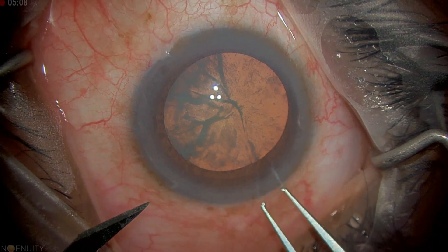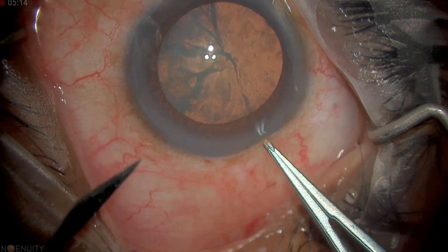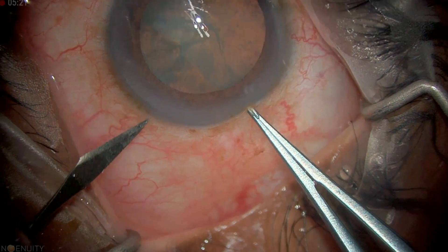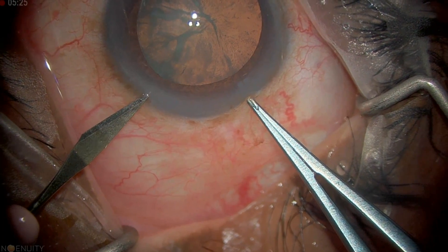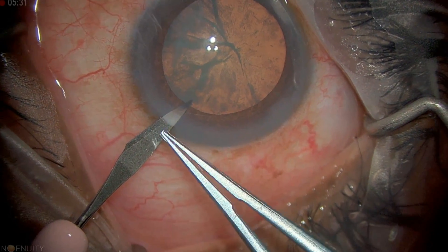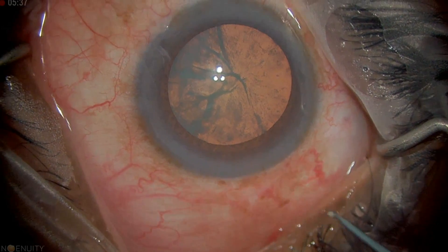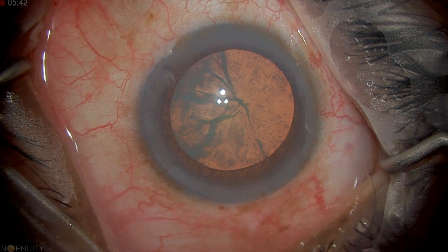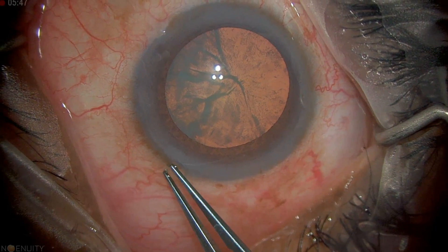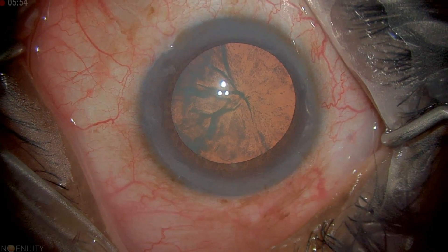I like to grab where I'm going to make my main incision. There are many ways to do this — I'll just show you mine. I like my paracentesis port about 70 to 90 degrees away, going pretty flat, just at the limbus, entering and going straight in. I'm looking at my internal diameter and gauging a diameter that will allow comfortable passage of my cannulas. I will also look to markings because sometimes it's very hard to know where this is — a little bit of conjunctival bleeding tells you where your site is.